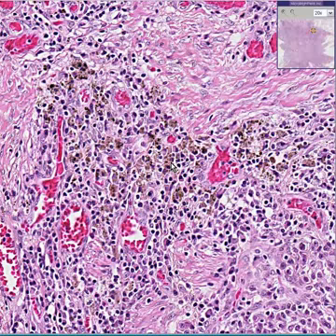But notice one more thing. Even though this whole big thing is a lung tumor, in this particular cut section, you could see a few tumor cells out here in the southeast, but the rest of this stuff is blood vessels, fibrous tissue, lymphocytes. So by pure weight alone, you would say the majority of this area is not actually cancer cells. The majority of this area by weight are cells that are in reaction to it, but you still weigh the tumor. So when you weigh a tumor and it weighs 2, 5, 10, 100 grams, it's often possible that the actual cancer cells, tumor cells, are a relatively small percentage of that, like they are here.